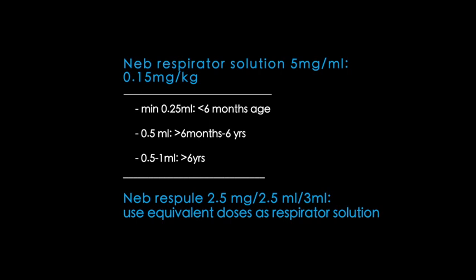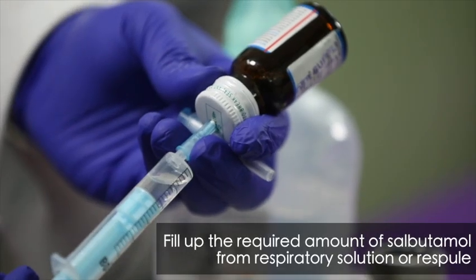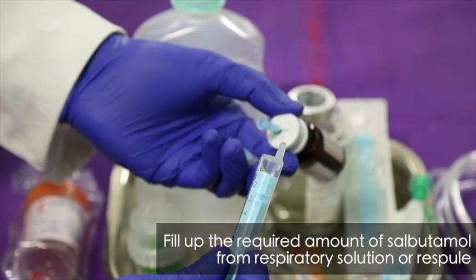The Neb respirator solution contains 5 mg of salbutamol per ml. The dosage for administration is 0.15 mg per kg. Taking age into consideration, the administered dosage varies as shown on the screen. For Neb respule, use equivalent doses as respirator solution. Fill up the required amount of salbutamol from respirator solution or respule.